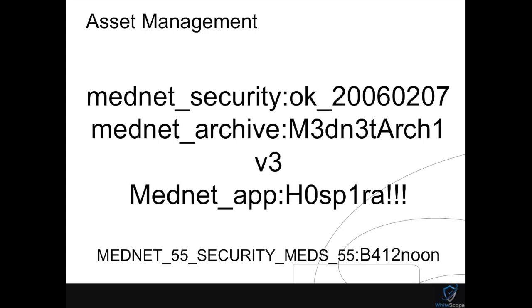They also have various keys they use for various things, and a lot of different passwords. These are all SQL Server accounts that all work as SA with the highest privileges. They have better passwords, not as easy to guess, but you don't really have to guess passwords when they're hard-coded into the software.